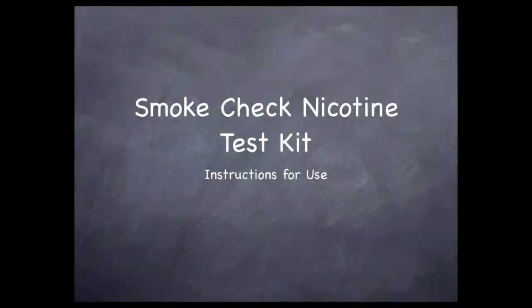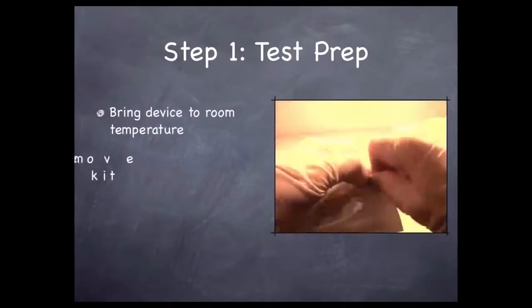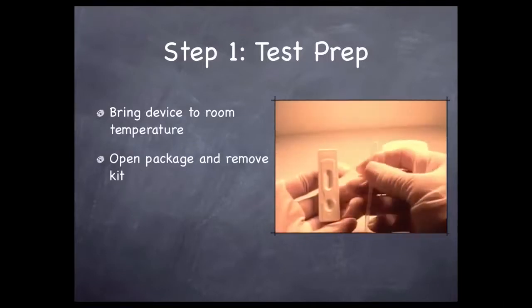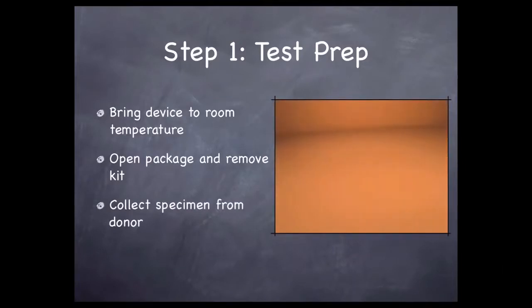Test preparation. First, bring the device to room temperature before opening the pouch to avoid condensation of moisture on the membrane. Open the package and remove the kit. Collect the sample from the donor using the provided cup and ask them to secure the lid before they hand it back to you.